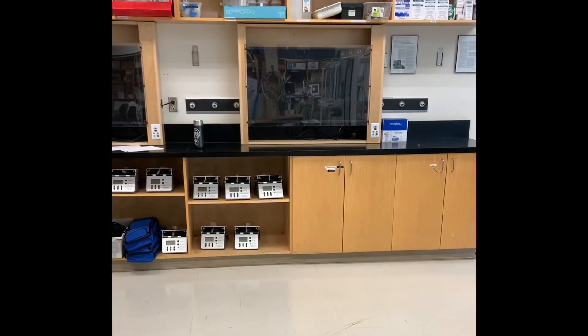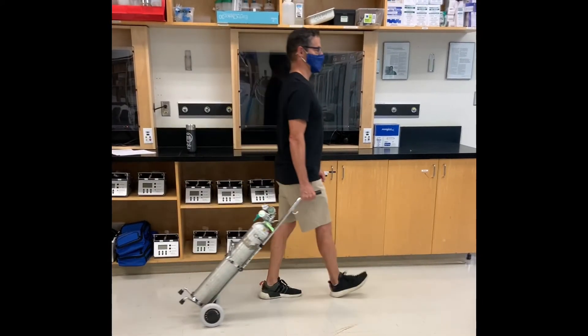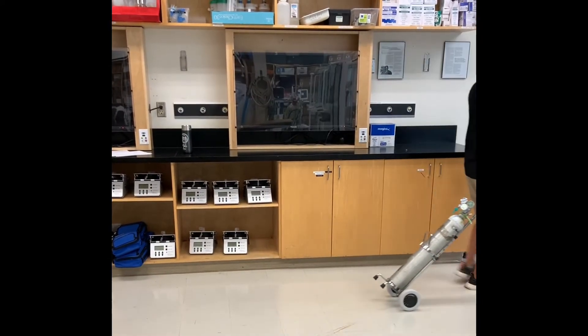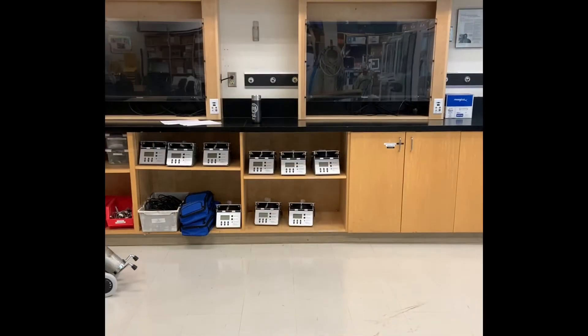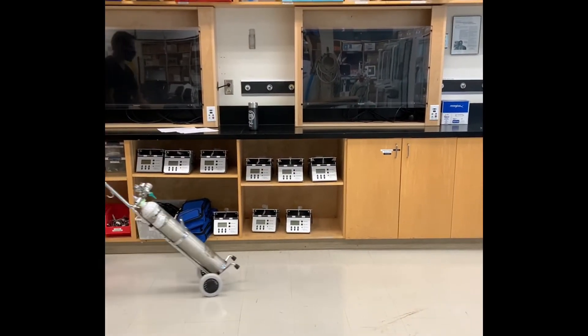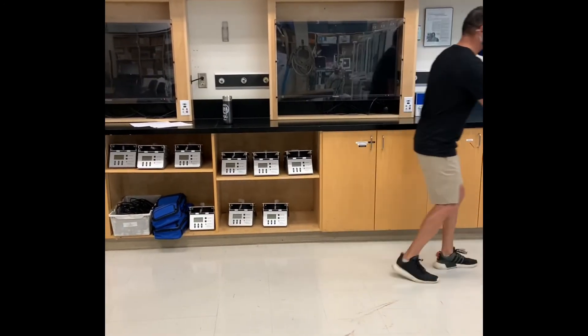Here's how you transport an E-size cylinder. It's important that you pull the E-size cylinder behind you, because it allows you to maintain optimum control. If you push the cylinder in front of you, it's harder to maintain control.